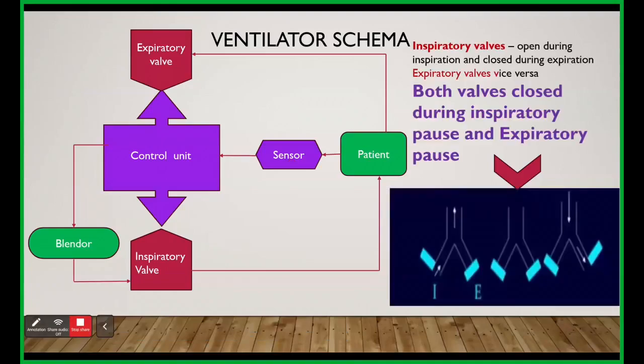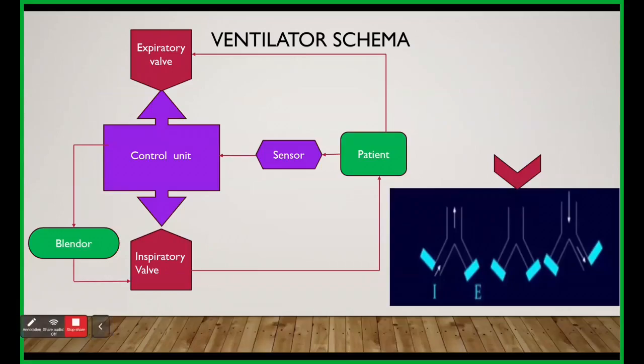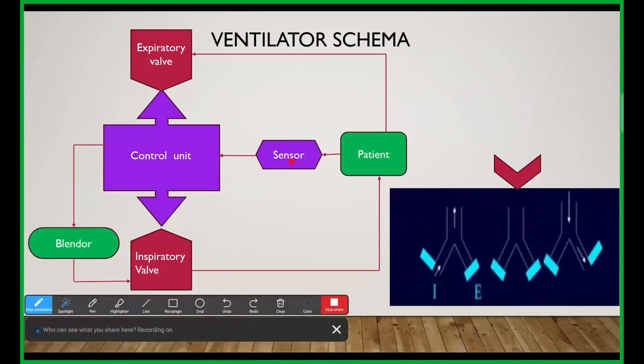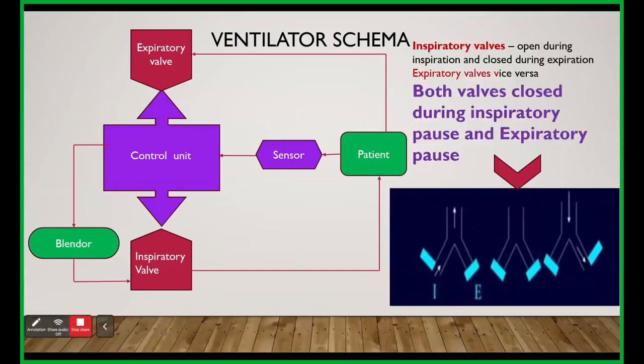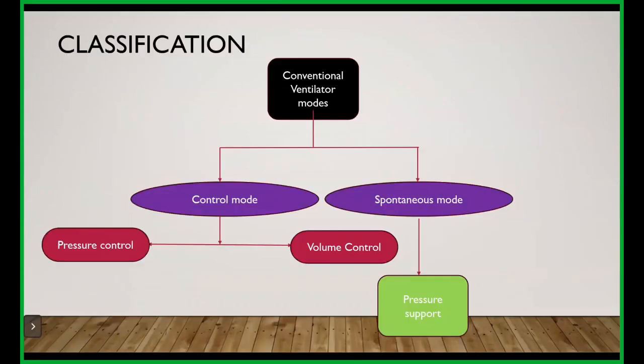So here is the schematic representation. During inspiration, the inspiratory valves open and the expiratory valves close. During expiration, your expiratory valves open and the inspiratory valves close. But during your expiratory pause or inspiratory pause, both the valves get closed. That is depicted in this picture.